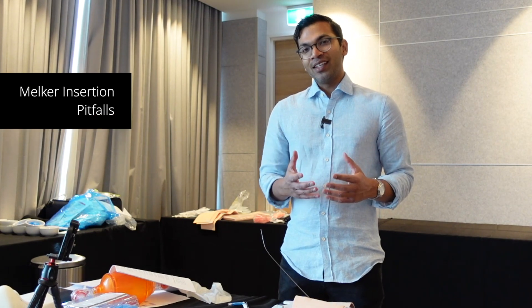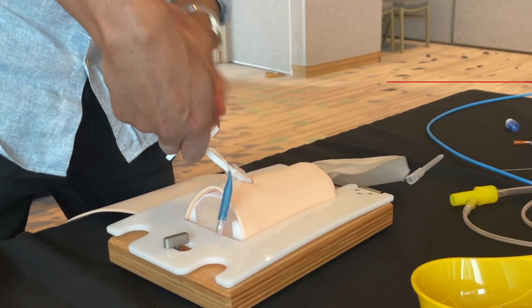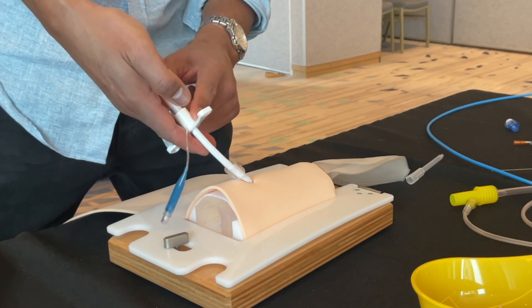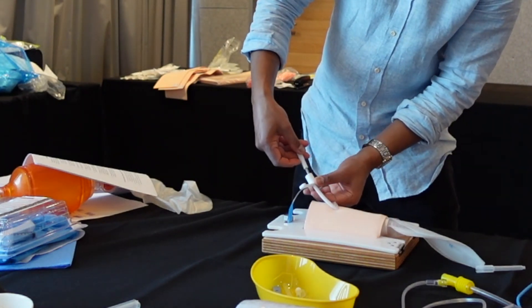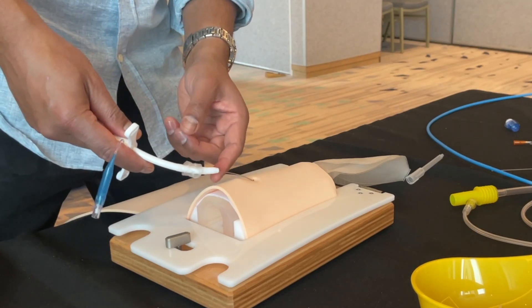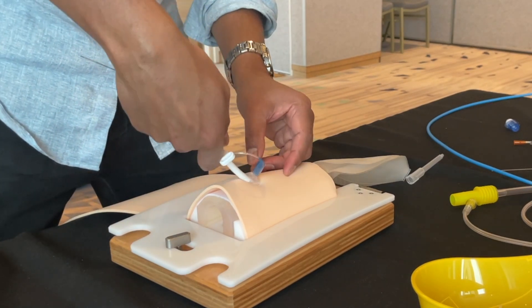There are a couple of ways the Melker insertion can go wrong. One is incorrect grip — if you're not gripping all devices together, meaning the cricothyroidotomy tube, the dilator, and the wire, you can get separation. The dilator might get pushed out, creating distance between the wire and the kit. The dilator creates a smooth surface so everything passes through easily.